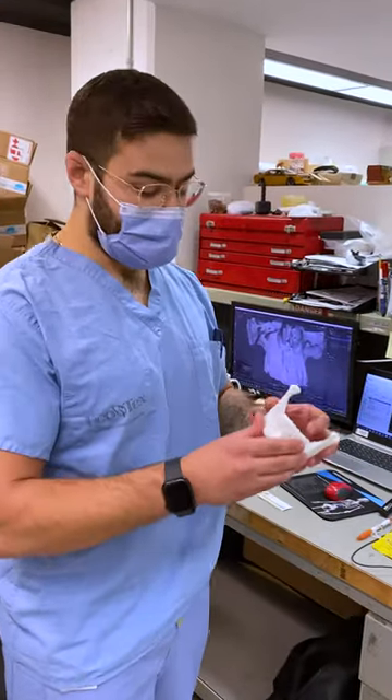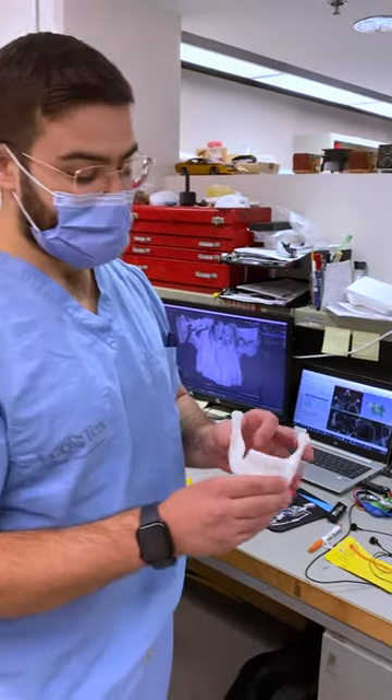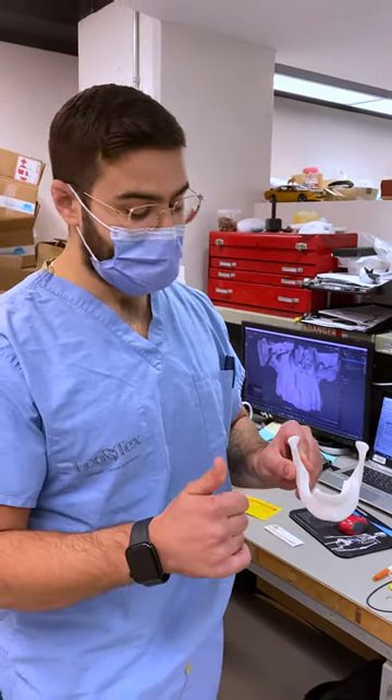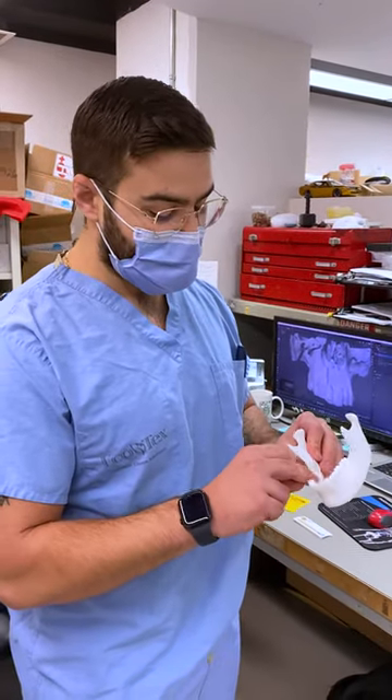From the 3D printers we get a model that looks like this — it's been cleaned, polished, and finished. With models like this we can see where a tumor used to be, and it provides the surgeon the depth and size of the tumor as well as whether it's close to any nerves.